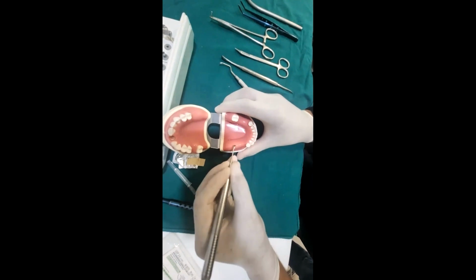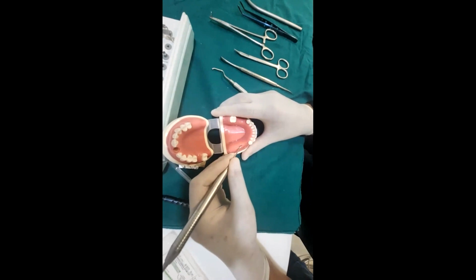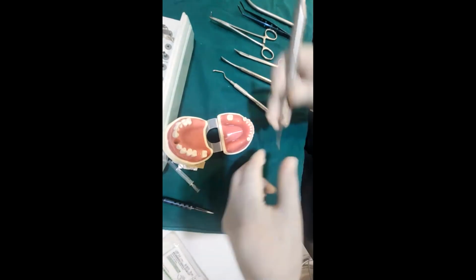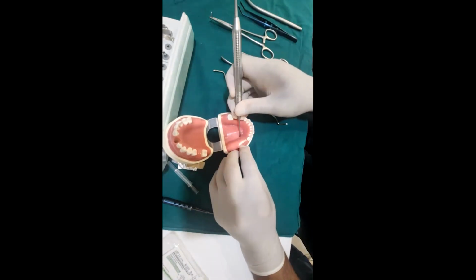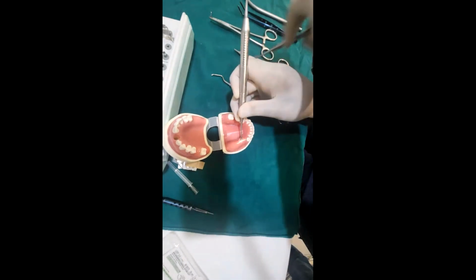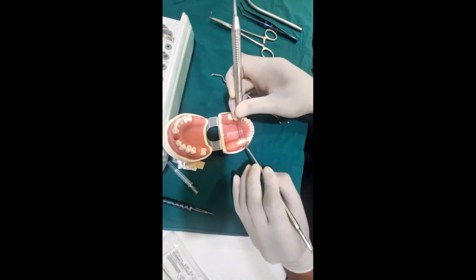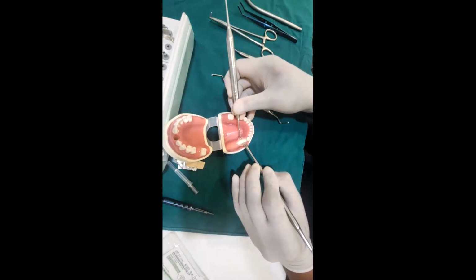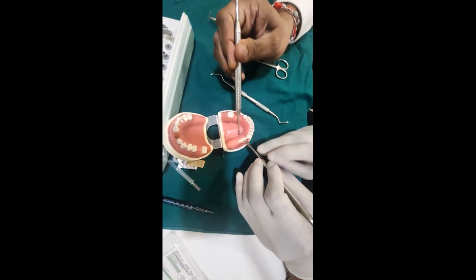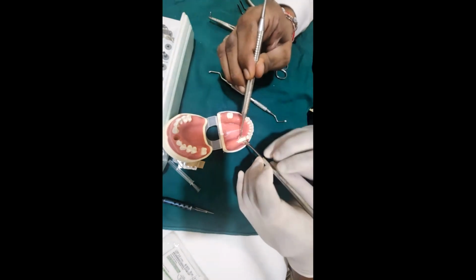I hope everybody can see clearly. So we have the flap which is raised and we have a good bone over here. You will have your associate generally reflect the lingual tissue and you are supposed to reflect the buccal tissue like this, or you can have a small soft tissue tag suture to ensure that there is no soft tissue which is coming when you are drilling.